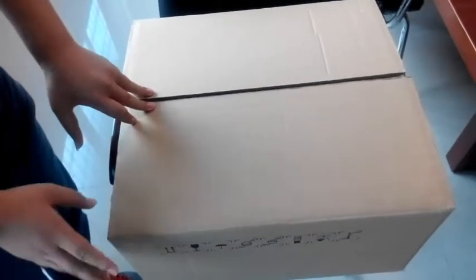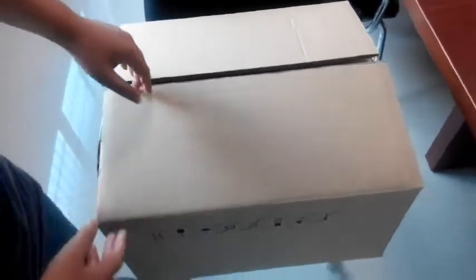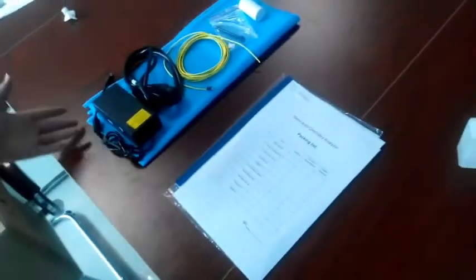After you get this box, you should check if it's damaged or not, then open it. You will find the spare parts, documents, and the machine.